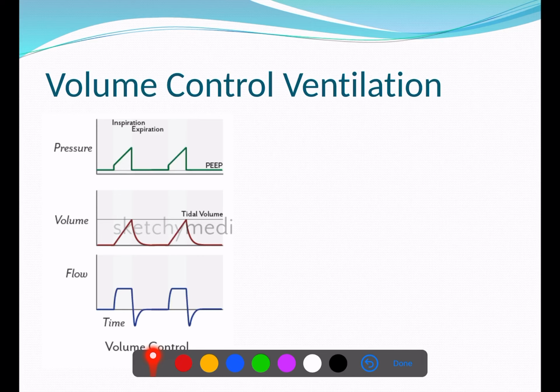The first is the end-tidal CO2 graph. The reason that's important for any patient with invasive ventilation, be that through an oral endotracheal tube or a tracheostomy, is that it is the only way that you can prove that that tube is in the trachea and not sitting elsewhere, that you haven't accidentally extubated. It is the most sensitive and the most accurate way of confirming the tube position. So tip number 1, always make sure that your end-tidal CO2 curve is visible at all times.